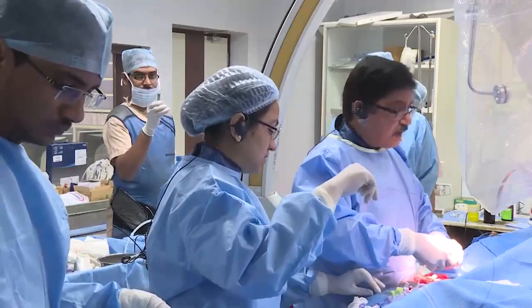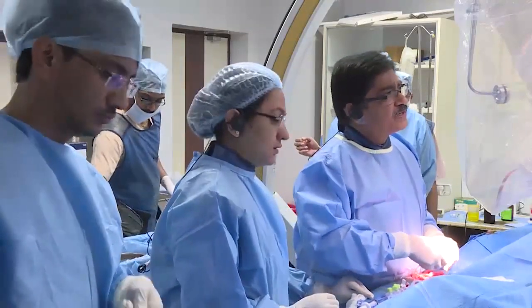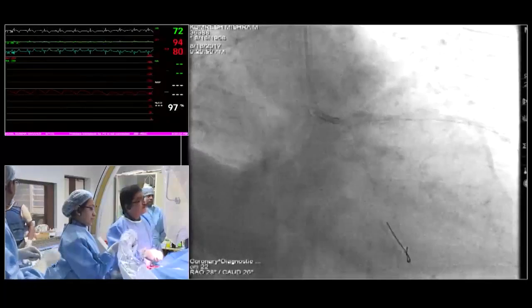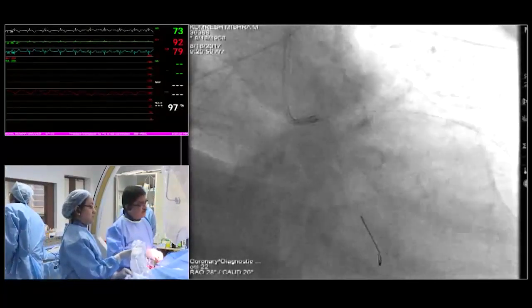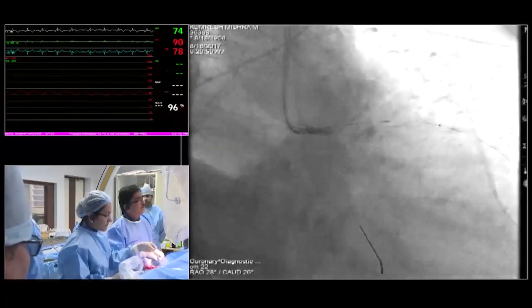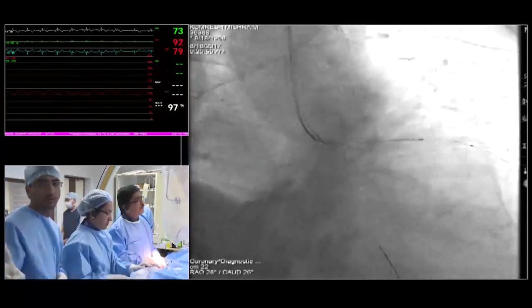Yeah. I have done some post dilatations after that. I'll now show you the final picture. Okay. This is the IVUS, yes. So I did it with 4.0 and I have done with 4.5, a little lesser pressure though, on the left main part. Yeah, okay, that's what we were feeling. It takes a little bit.